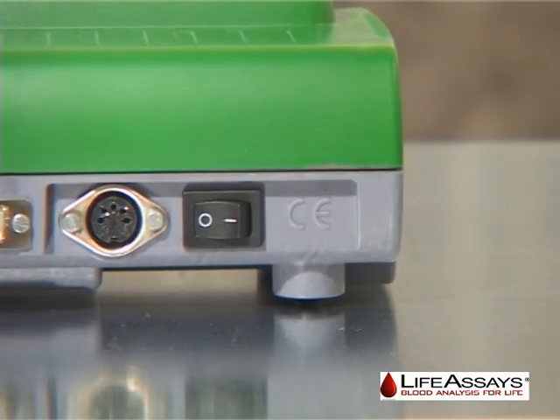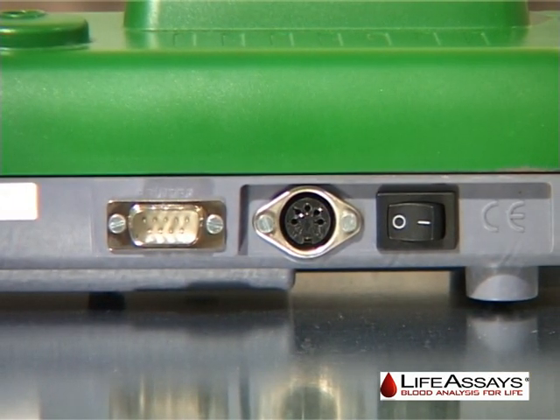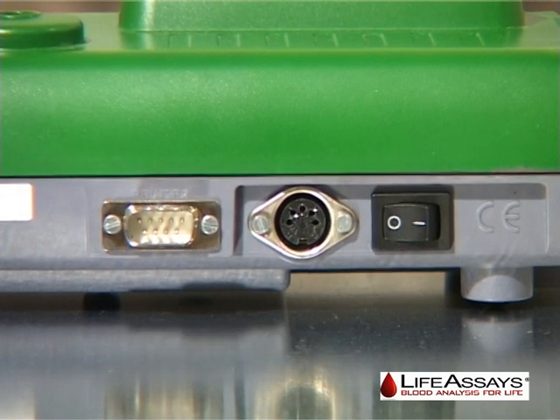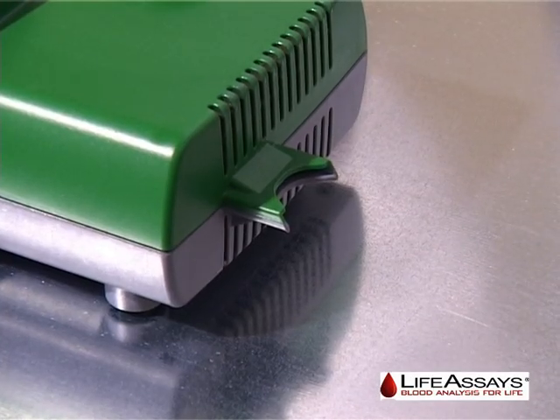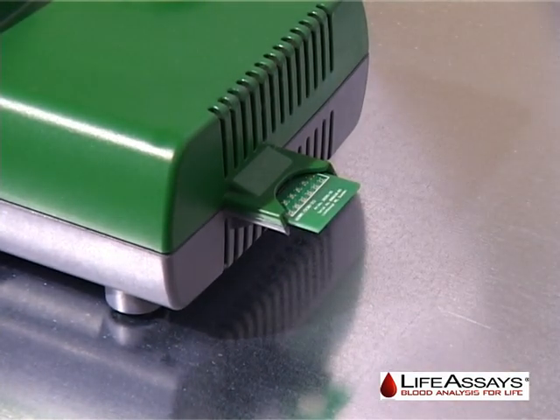On the back side of the instrument, you will find the on-off switch and an RS-232 input for connecting the VetReader to an external computer or printer. On the right side of the instrument, you will find a slot for the disposable algorithm chip.